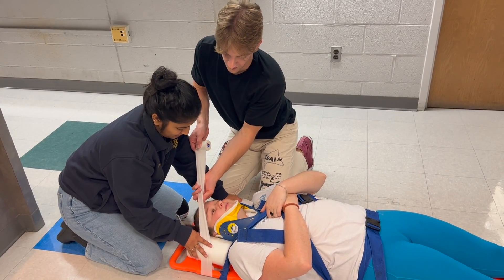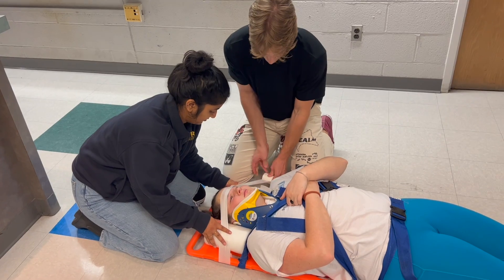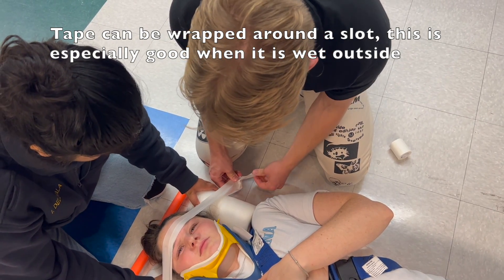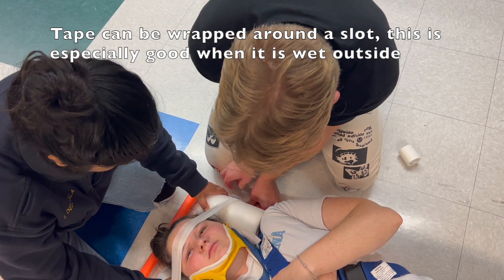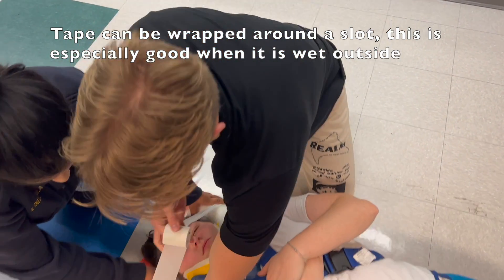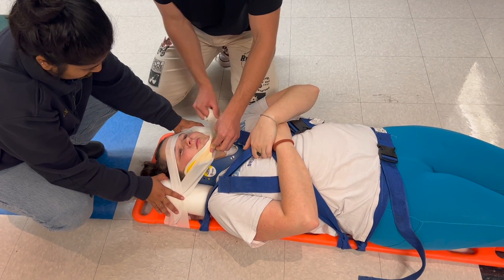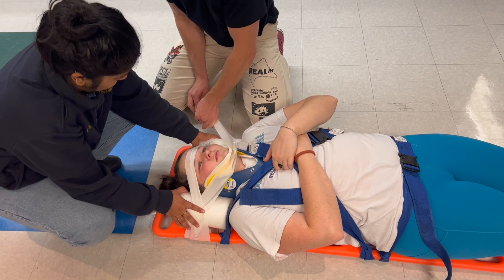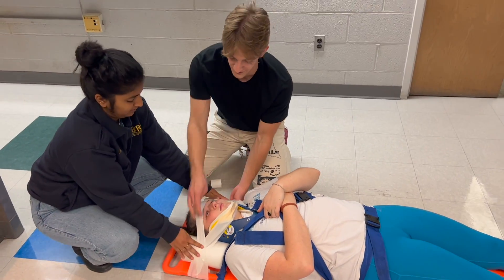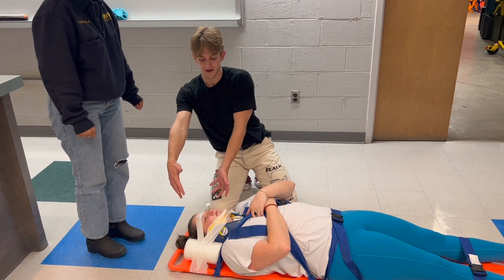I really don't want to rip her eyebrows off, but do not fold the tape in the field. You will tape over the forehead and to the other side of the board. Make sure you tear off a big piece of tape because you don't want to end up with too little. Tape very securely and then repeat this procedure, starting from the same point — you may even want to cross like an X here, going over the patient's chin on top of the C-collar. I'm wrapping around the back of the board and crossing over the tape going over the forehead. At this point my partner can finally remove inline manual stabilization.